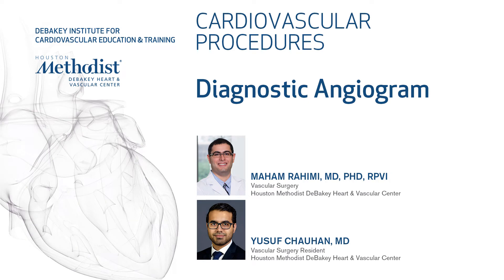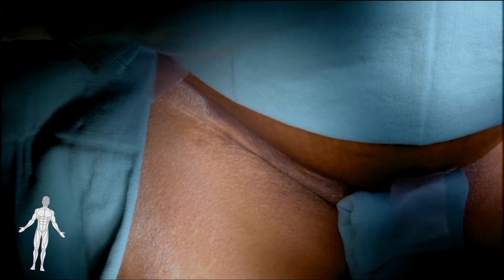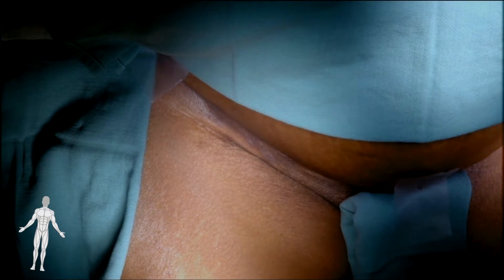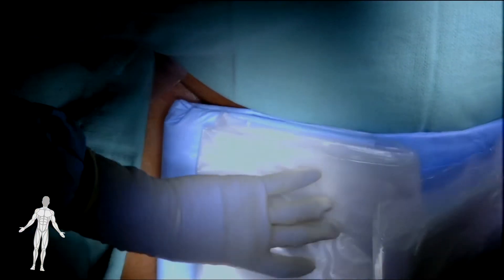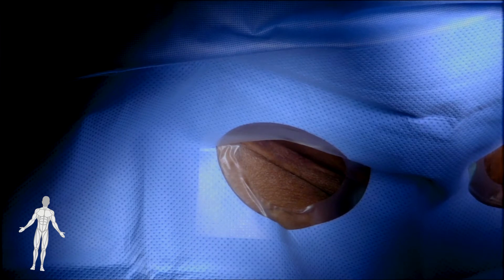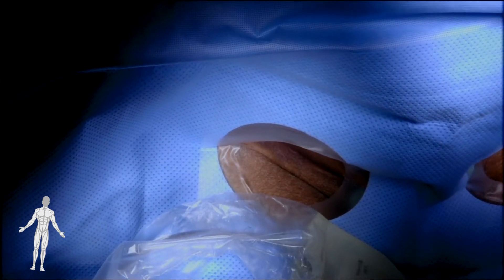This video will demonstrate the procedure to perform a left lower extremity diagnostic arteriogram. The patient is an elderly female with a history of multiple left lower extremity endovascular interventions who presented with a 3-day history of rest pain and discoloration of her left 4th and 5th toes. Ultrasound arterial duplex of the left leg demonstrated an occluded left SFA and ATA with reduced Doppler signals in the remaining vessels. The decision was made to perform an arteriogram of her left leg.